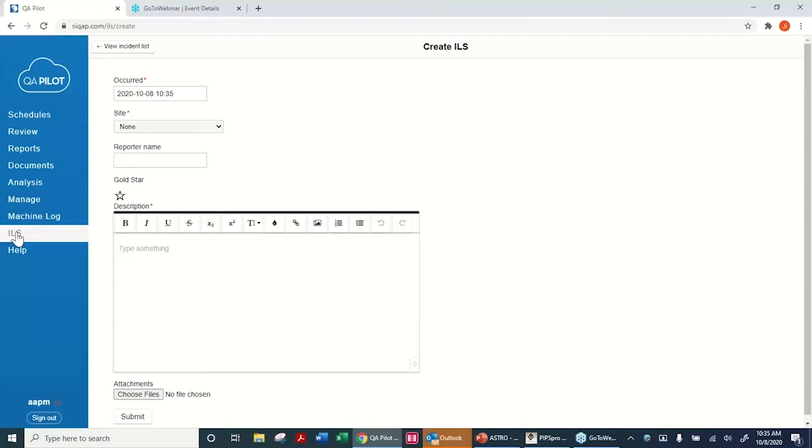We always want to improve the patient outcomes, the patient experience. Well, here you can begin to track some of those things that were near misses or things that you felt were clunky in the workflow. And then as your committee gets together or your departmental administration gets together, they can review what kinds of things happened in the past quarter. Well, if this certain type of incident occurred 6 times over the past 2 months, that kind of indicates we've got some work to do on improving that process.